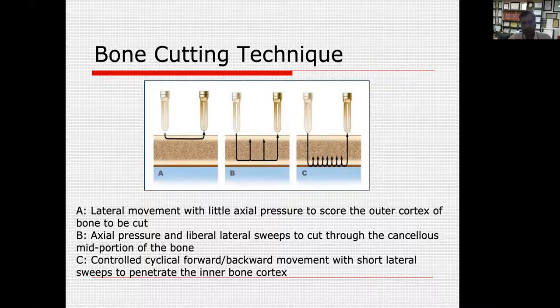So this is the C step. The third step is the most crucial because here you have to develop the tactile feel to feel for the inner cortex breaking away or giving way.